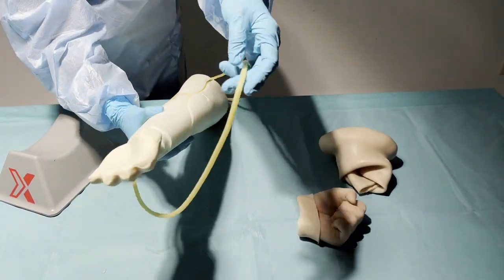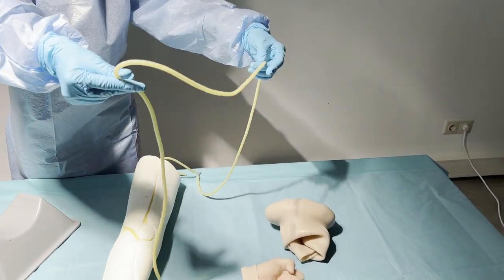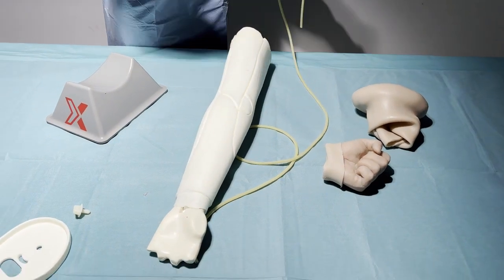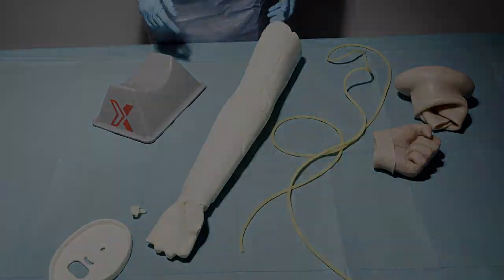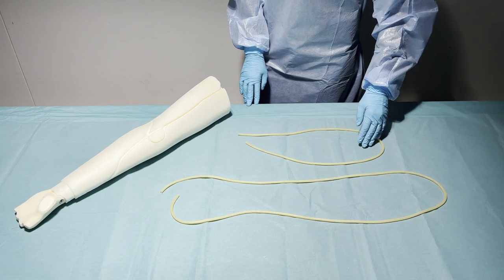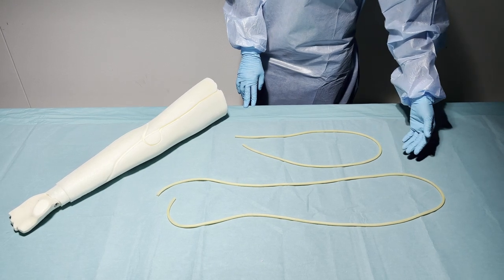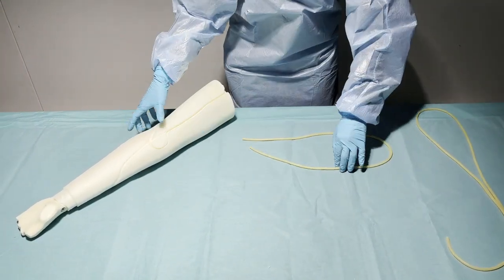You can remove the veins from the arm internal material. You will notice there are two loops of the veins. After you have removed the veins from the IV arm, you can place new ones back into the arm. You need two tubes to do that — one small one and one big one. The small one is 90 cm and the big one is around 150 cm. First we place the small one back.